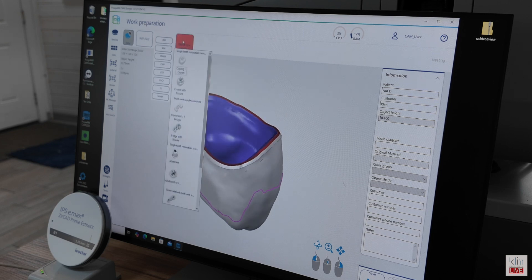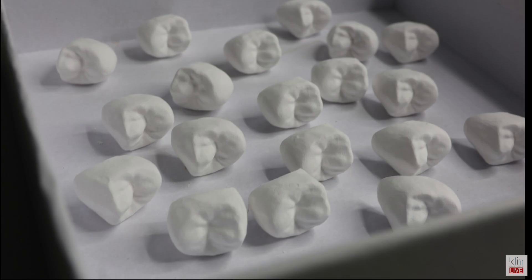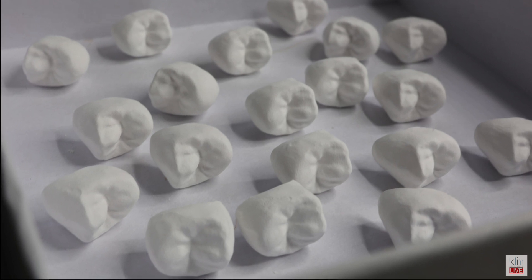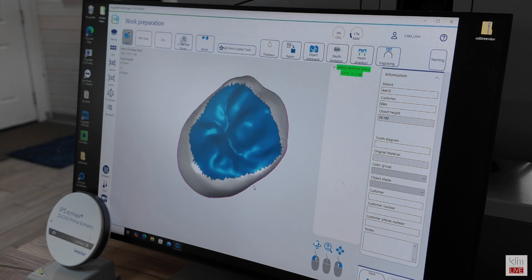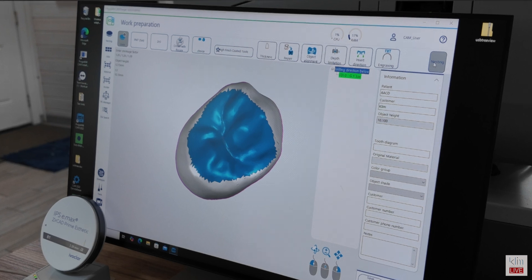Under object type, we're going to choose the crown with fissure. That will provide excellent mill clarity down to the 0.5 burr, which results in really detailed anatomy, particularly on the occlusal surface. You will find that the CAM software for the Ivoclar milling units is fairly automated, even though there are a lot of options you can tweak. If you set the case up well in the design software, there's not a lot to do outside of placing that in the disk.